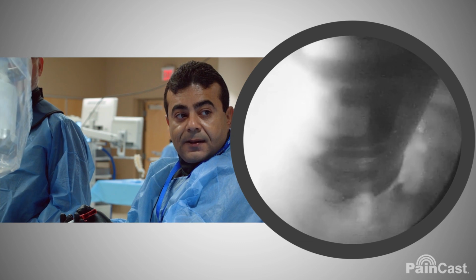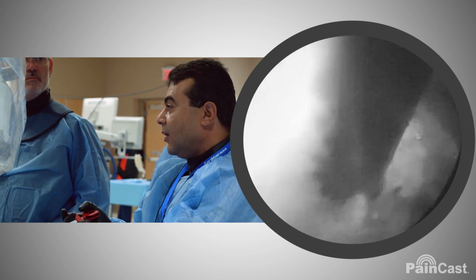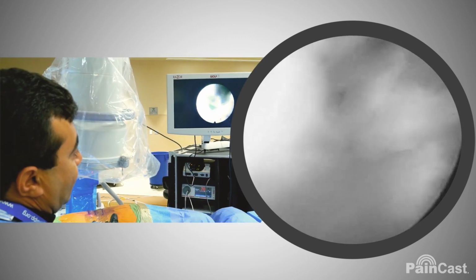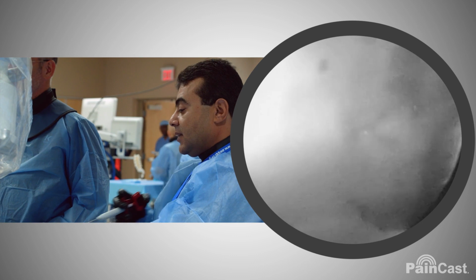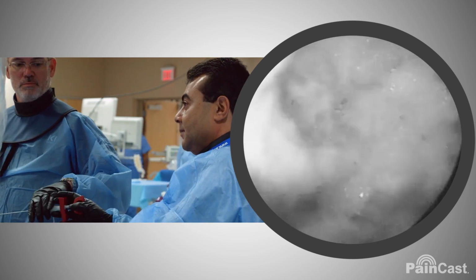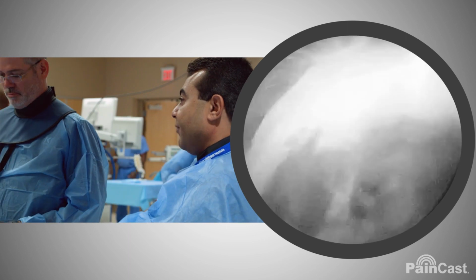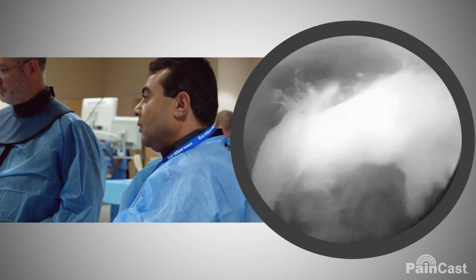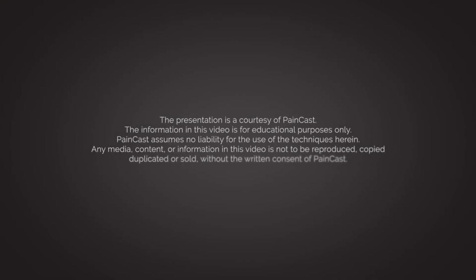And we're going to confirm exactly where we have our equipment on an X-ray again. AP view. Here it is. I'm almost in the center in an AP view, but I am very shallow. So this is the endoscopic discectomy using a 7mm scope Wolf system, doing an inside-outside technique. Thank you.